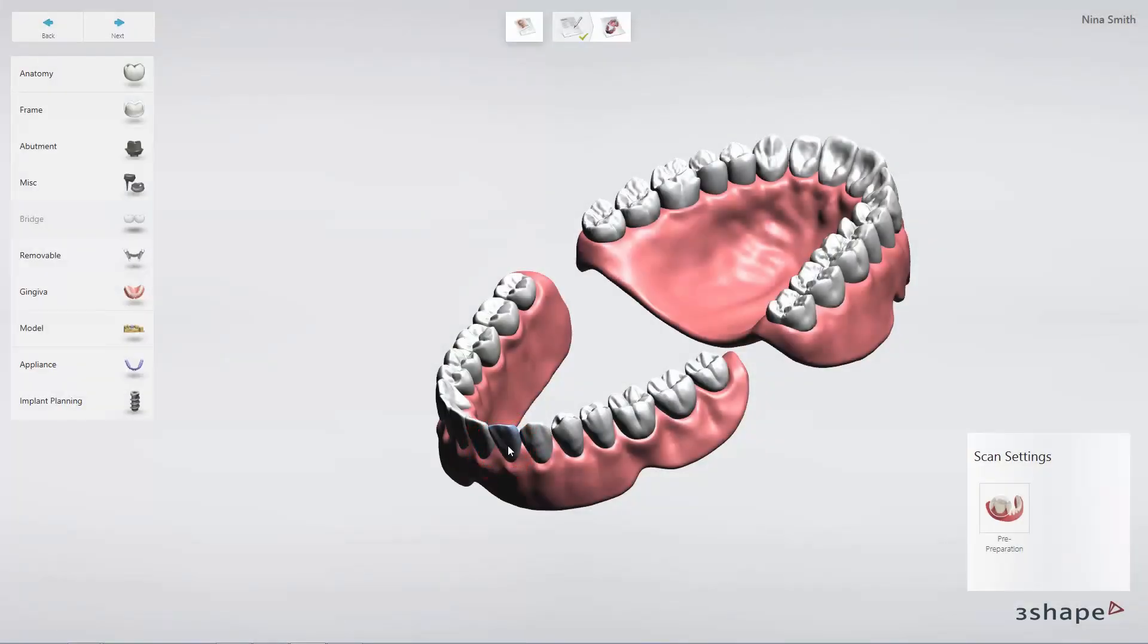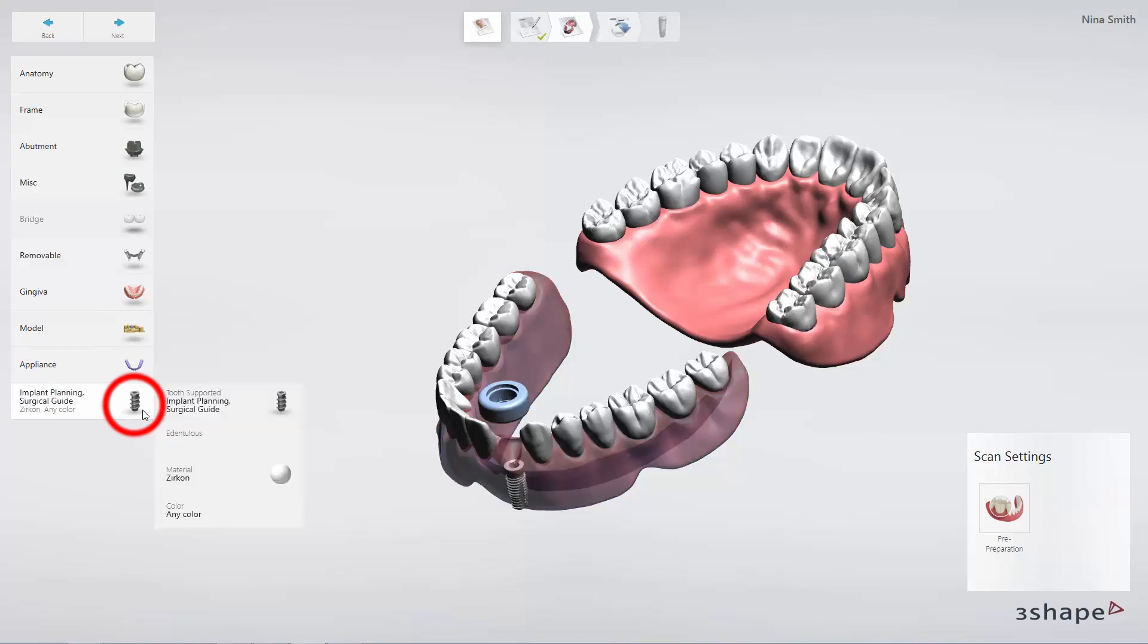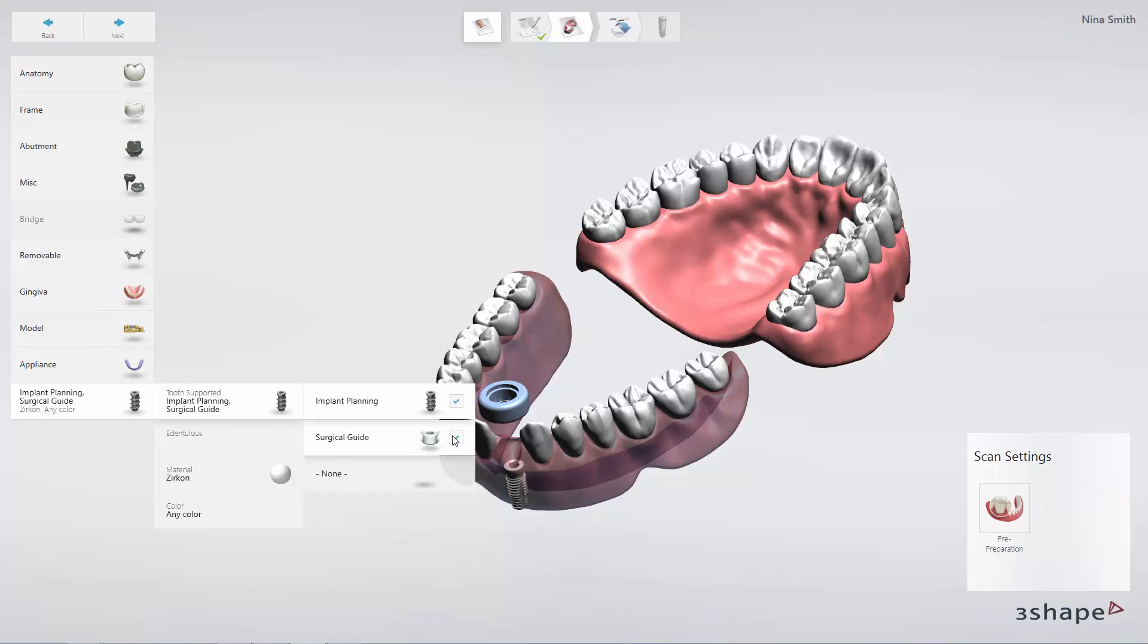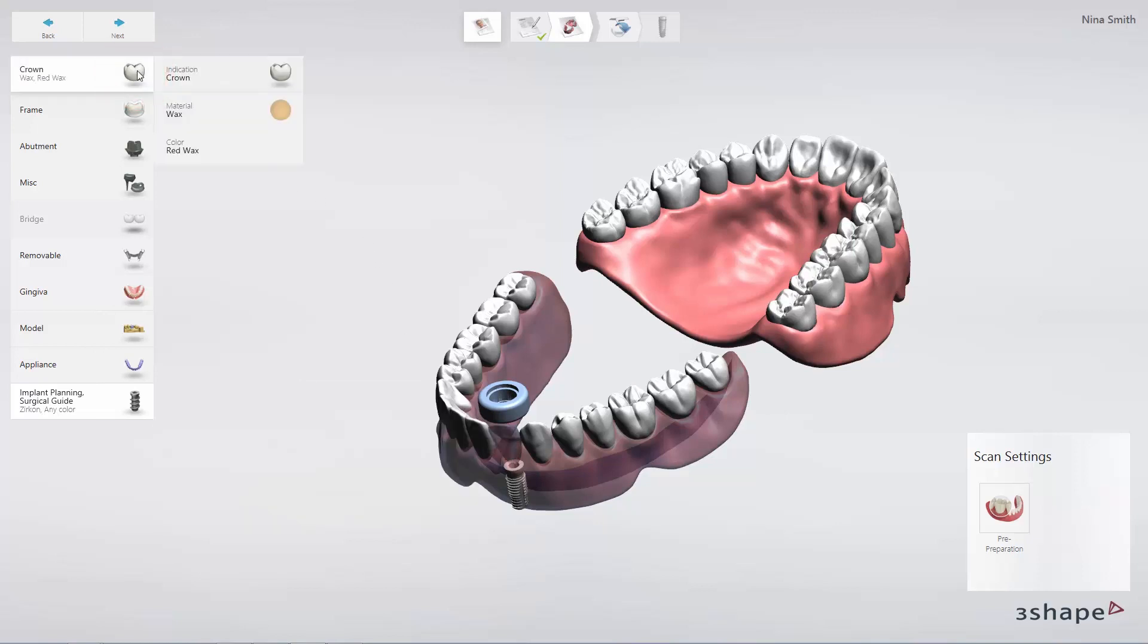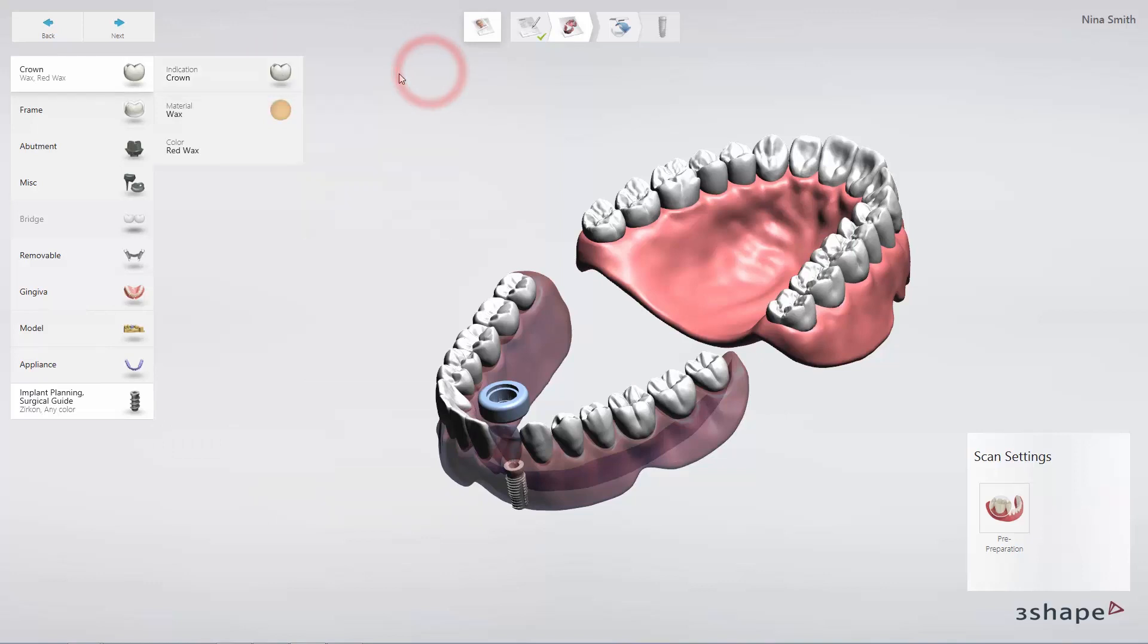In this first example, I will choose a tooth supported guide, Implant Planning and Crowns for the mandible. Click Next to proceed to Scan Import.